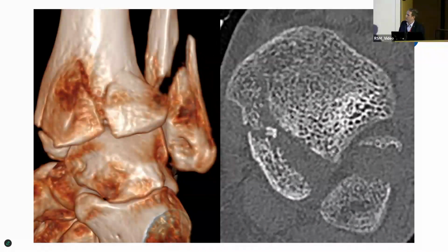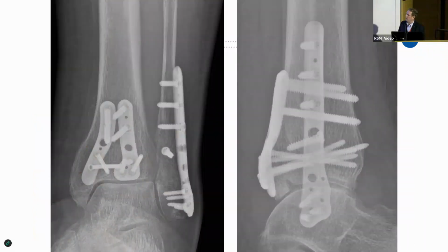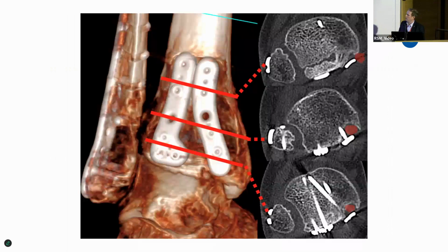So for example, this is a case that was done in our unit. It was a posteromedial rather than MPM approach. They didn't see the medial aspect and they put the screws in. And what they've done is put the screws through the tib post all the way down. That patient couldn't get the medial aspect of the foot to the ground and had to have that plate removed. If you're doing the MPM, you can see all that. You can see where the tib post is lying.